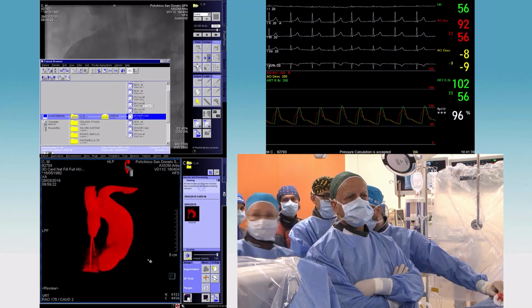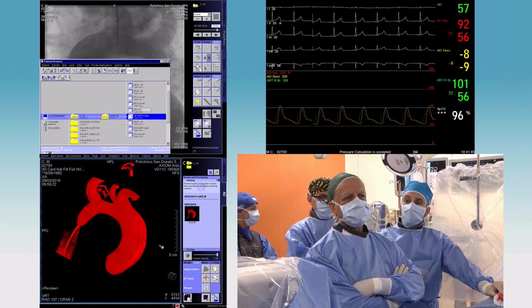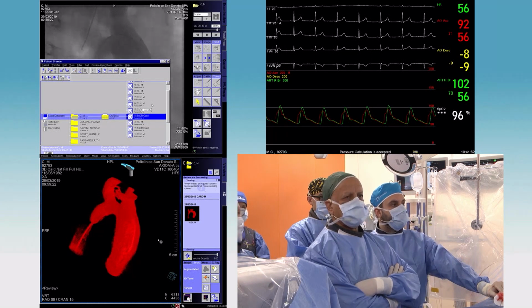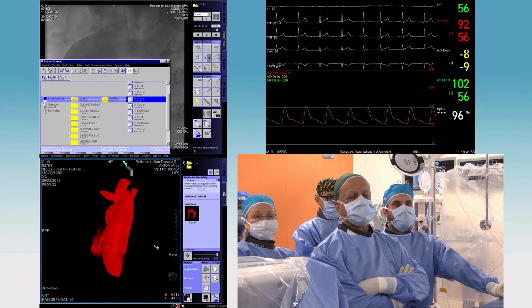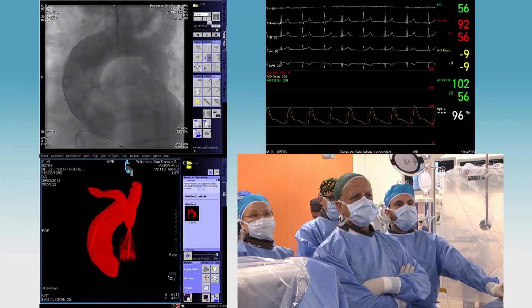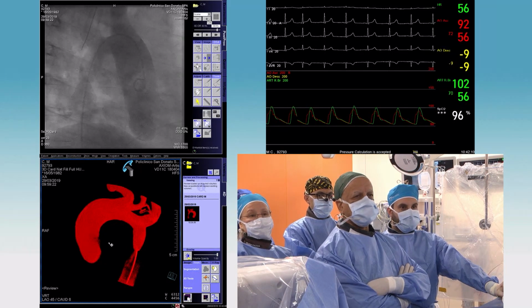I'm trying to remember who you've got with you. I think Carlos or not? And we have Axel, Carlos. Carlos asked about the measurements. Yes, hi, Carlos. So the measurements, we'll come to those in a minute from angiograms. Obviously, the CT and MRI measurements you've seen from Francesca, they were around 18 millimeters, just distal to the left subclavian artery, 21 millimeters post-stenotic dilatation part, and about 4 or 5 millimeters the narrowest part.